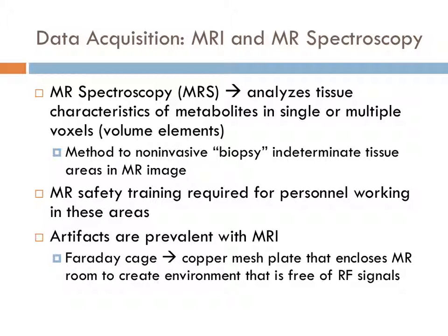MRI also has artifacts, just like CT. A Faraday cage is a copper mesh plate that encloses the MR room to create an environment that is free of radiofrequency signals. So it kind of encapsulates the MRI room.